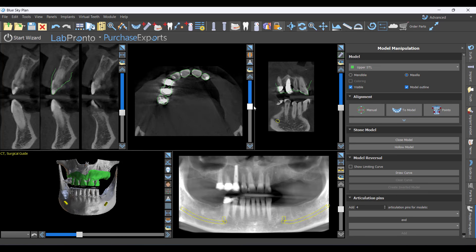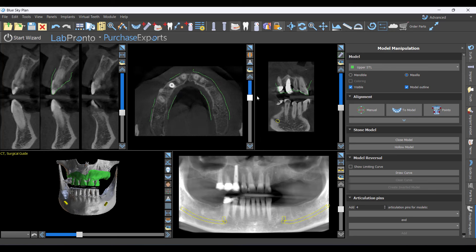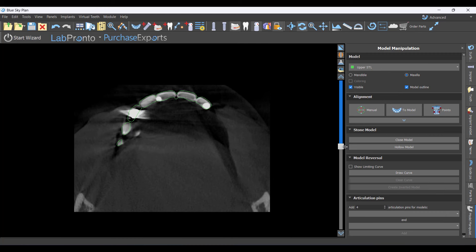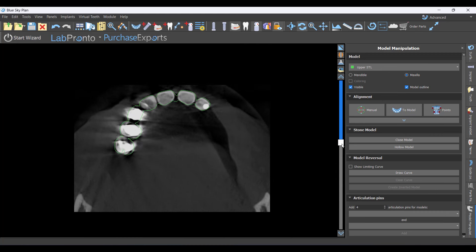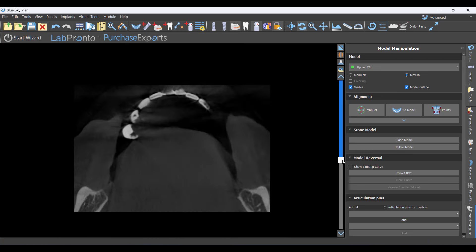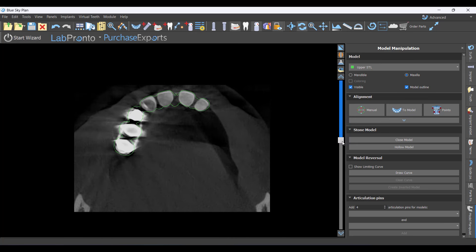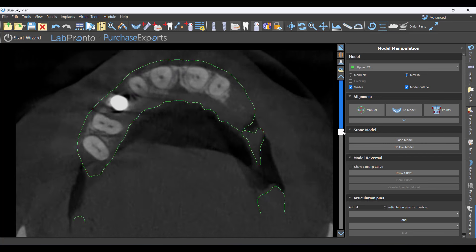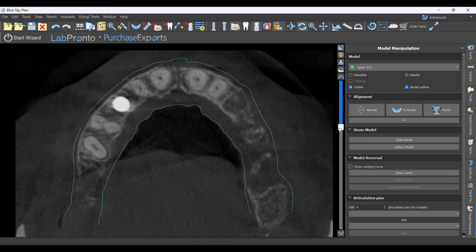I've got older videos on how to deal with heavy scatter cases, or sometimes you just need a scan appliance. I always verify the stitch in the axial slice — I'm looking for that really tight adaptation where the green model outline disappears at the same rate as the CT data. Furthermore, in the airspace you can distinguish the tissue boundary of her palate, and the model alignment should track right along that.